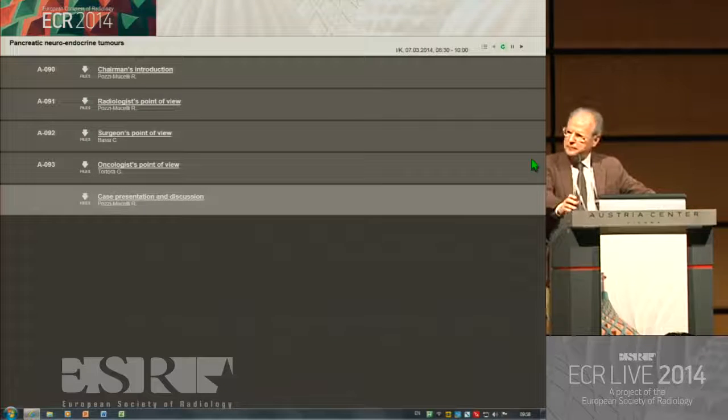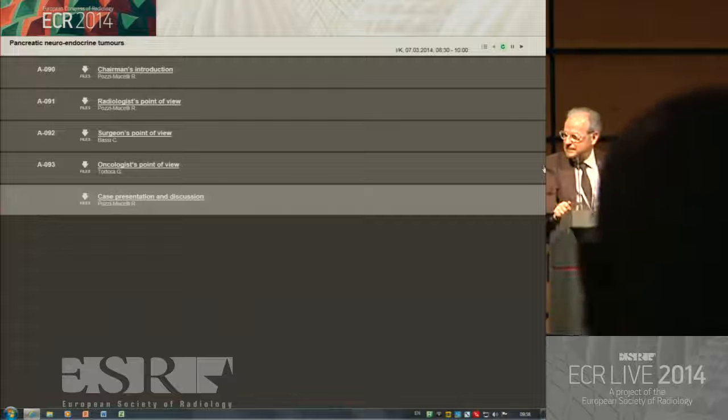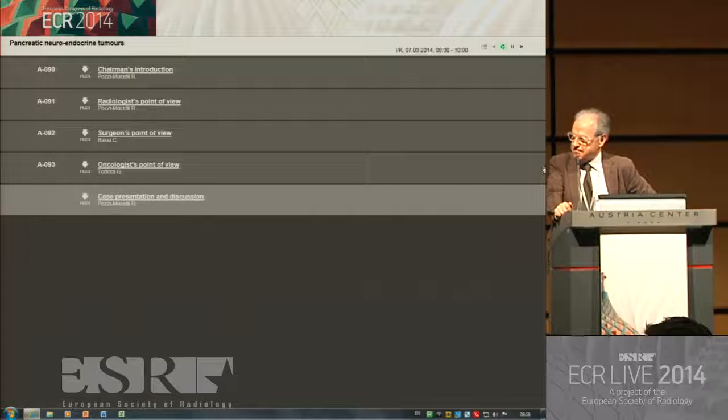Well, I have no experience with texture analysis. The attempt of perfusion CT was to approach the type of problems you mentioned. I think what you propose is a matter for research study. Yes, I mentioned this because we did this with metastases from colorectal carcinoma, and the response to treatment, which was bevacizumab, is forecast by the texture analysis. So I think this can be a good point to analyze.